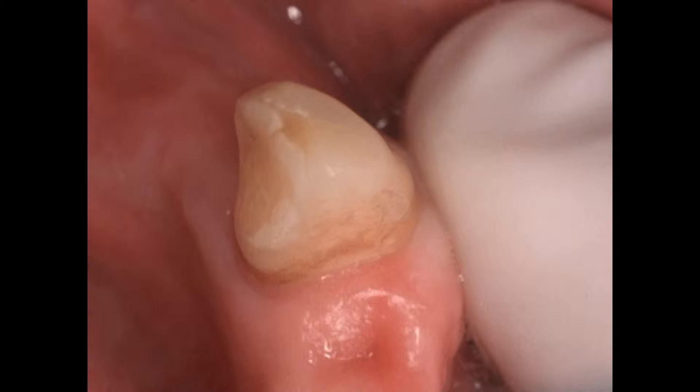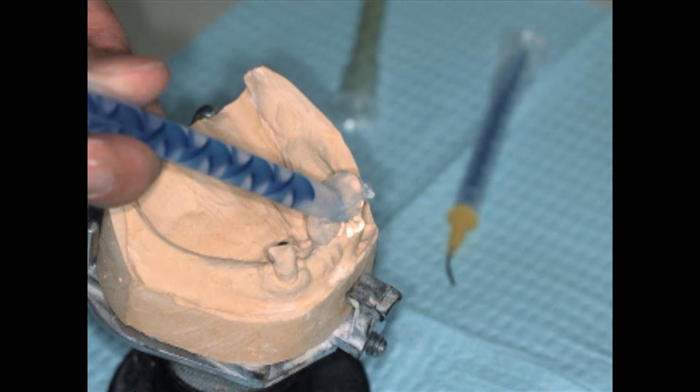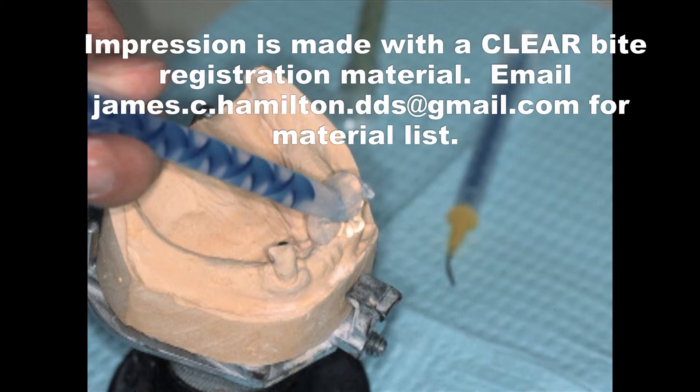Here's what we do now: on a study model, we actually wax up exactly the way we want that rest seat to look. We can then put it on a surveyor and make sure that if we want a guide plane, we can make it that way. We contour it exactly the way we want, then take an impression of the study model. No separator is needed — it's just a small impression of that tooth, and we did it on the other canine also.